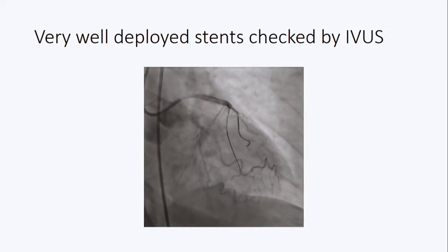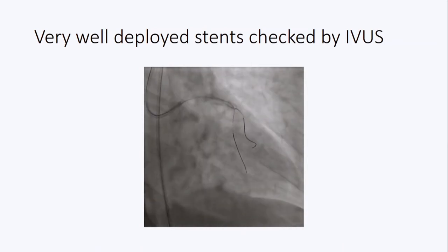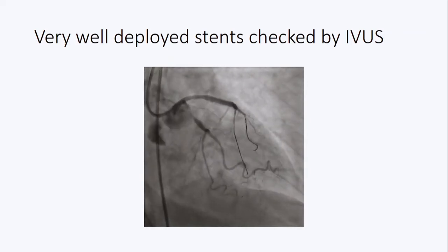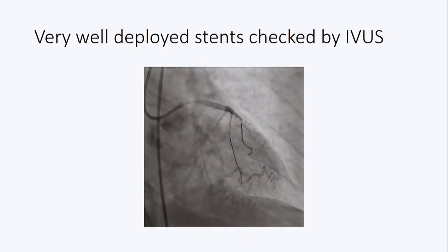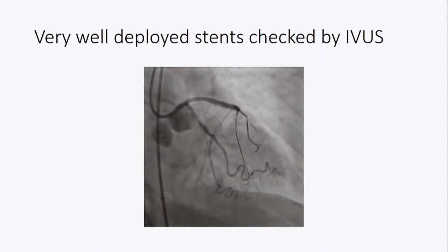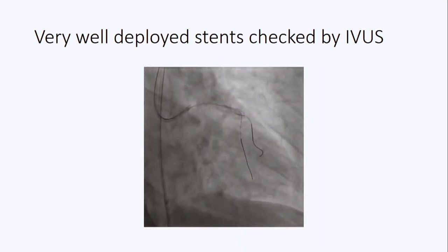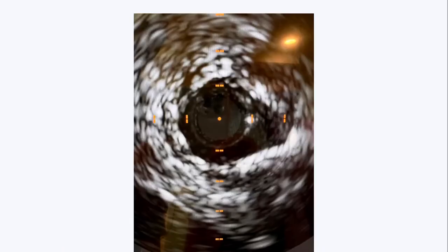Please note the size discrepancy. By the way, this is all full of plaque, all the way to the left main, but we decided to leave it and give her major lipid lowering because it looked angiographically okay. And this is the area which has been fixed. Please note the distal LAD. I mean, you really don't want to go down there.